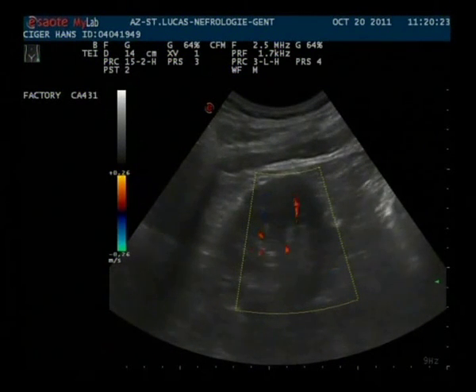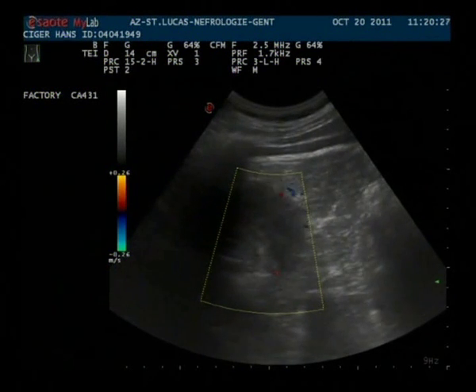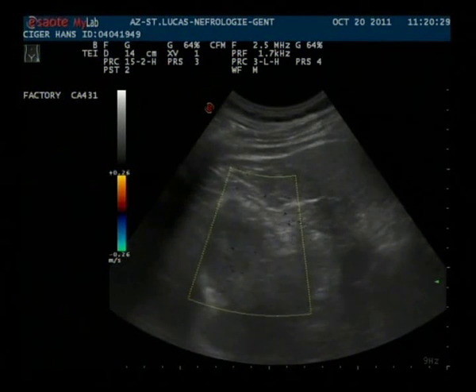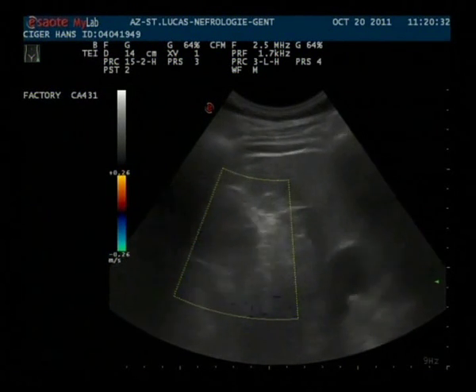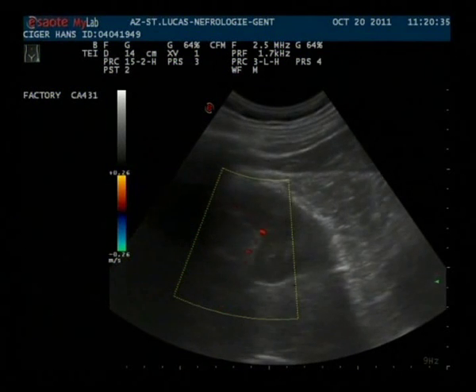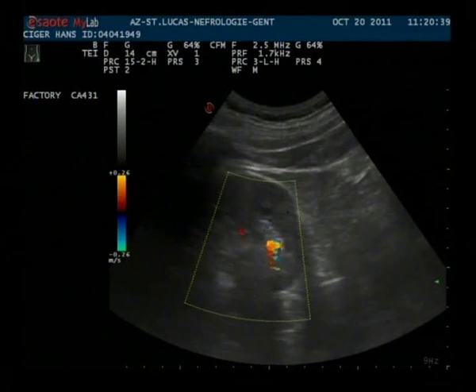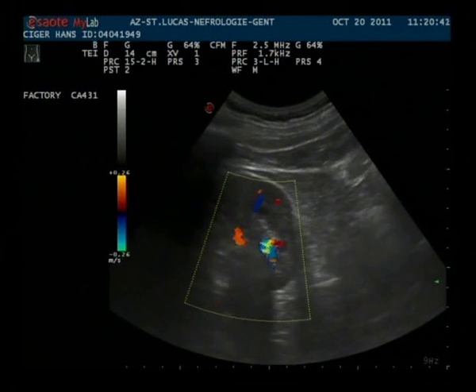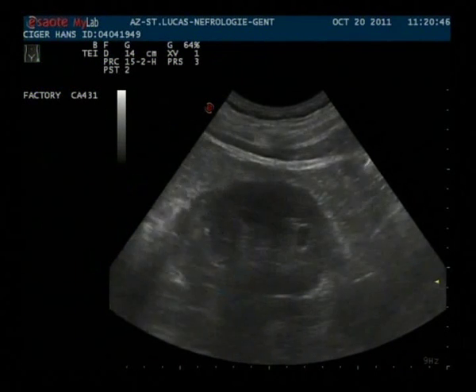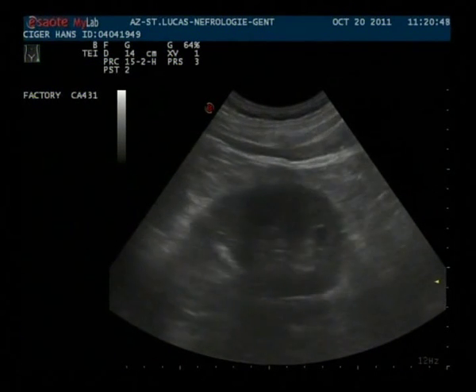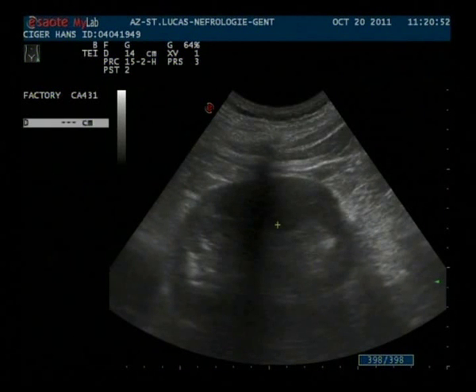There are two pieces of advice to get the twinkle artifact more pronounced. First of all, use a low color Doppler frequency, because this will create a more intense artifact. Secondly, it is advisable to increase the color scale. By doing this you will eliminate the normal frequency shifts and the kidney stones and the twinkle artifacts will become more pronounced.